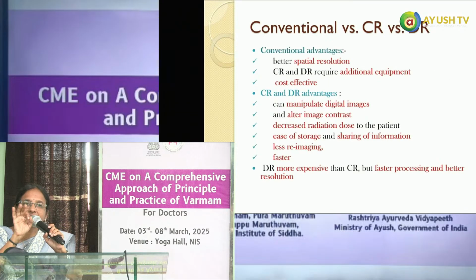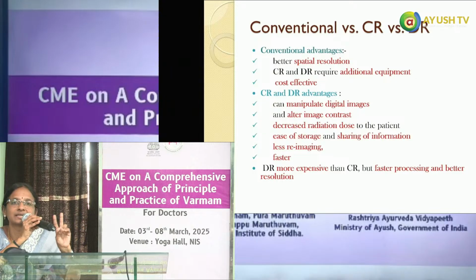So now we know there are three types: conventional X-ray, computer X-ray and digital X-ray. Now which X-ray should we choose? For that we need to know the advantages of each. First, conventional X-ray and its advantages.